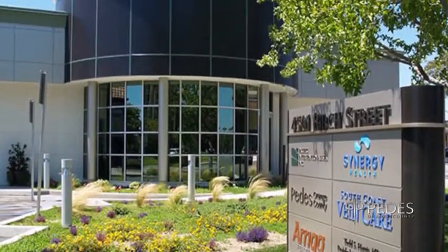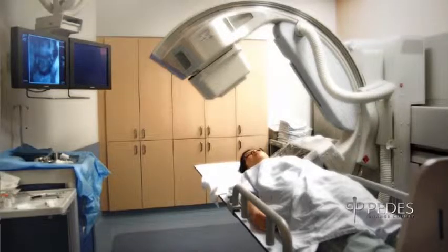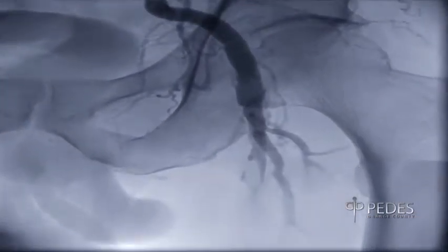If the ultrasound shows us that you probably have significant peripheral arterial disease in your legs, we're going to recommend that you have an angiogram to look into this problem further. What this means is that you'll arrive at our center in the morning and you'll be taken to the operating room. We're going to clean you up, give you some pain medication, and make you nice and sleepy. We're then going to put a catheter inside your arteries and inject some very safe contrast dye down your legs in the arteries. We're going to use an X-ray machine to take pictures of all of your arteries so that we get an exact idea if you have significant blockages and where they are.